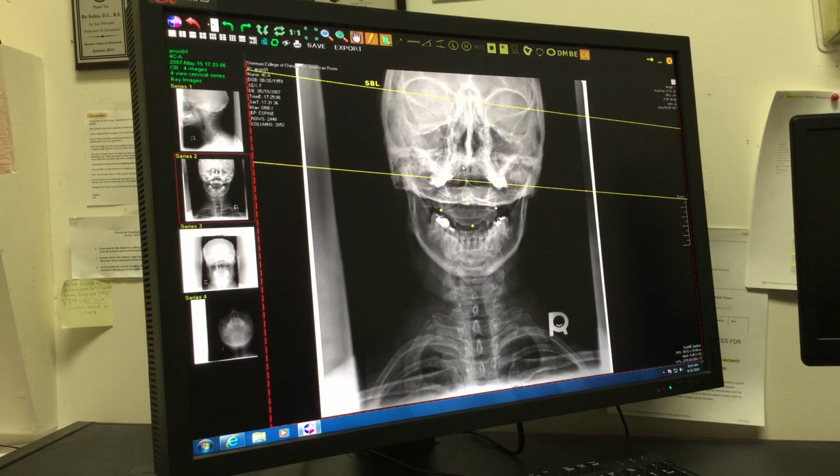So we're going to click off of that line. Remember that that inferior baseline also represents the side and the visual amount of the patient's head tilt, so it must be created parallel to your superior baseline. Let's go ahead and click a text box here and label this IBL for inferior baseline.